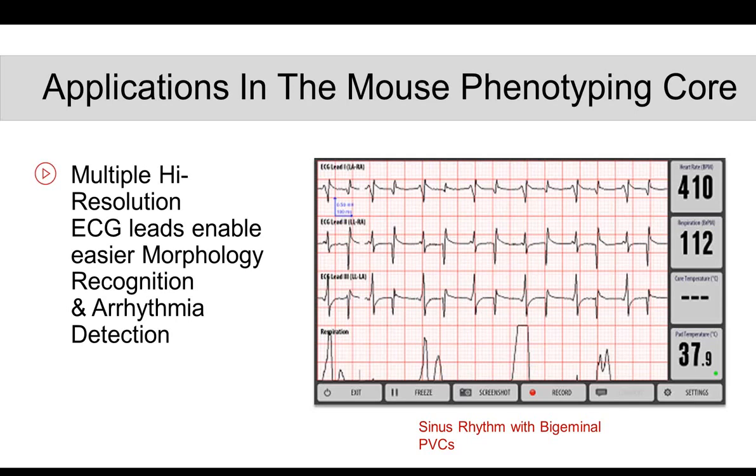And we do this on a daily basis. It's quite easy to use. Generally, you keep an animal down for 8 to 10 minutes and you can get the data that you need.